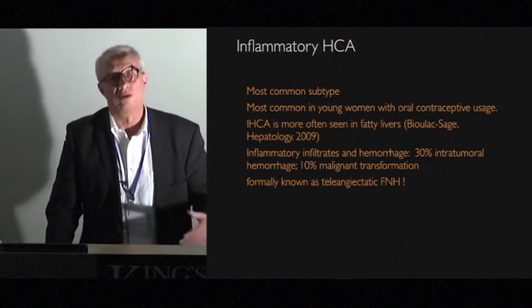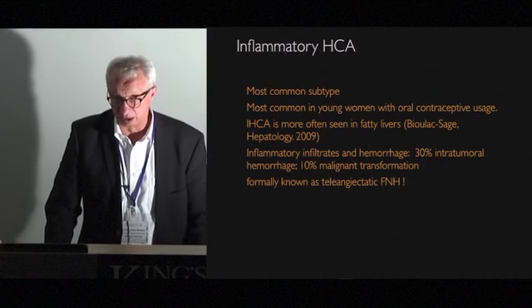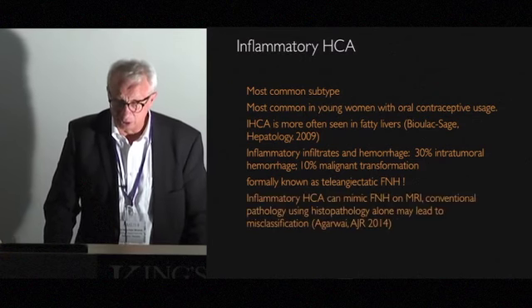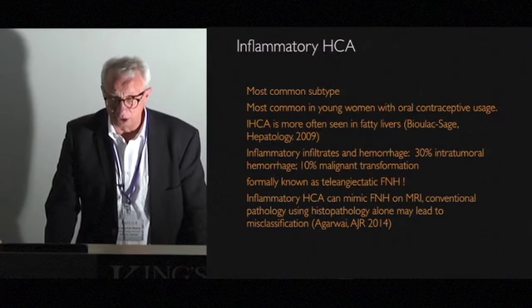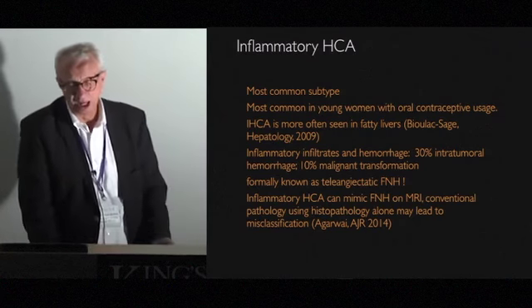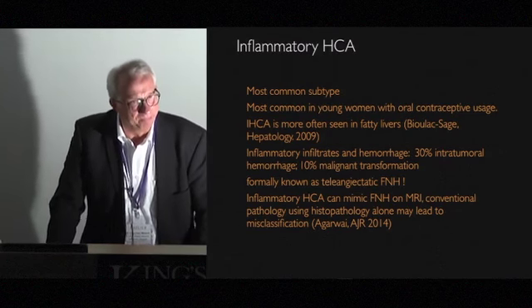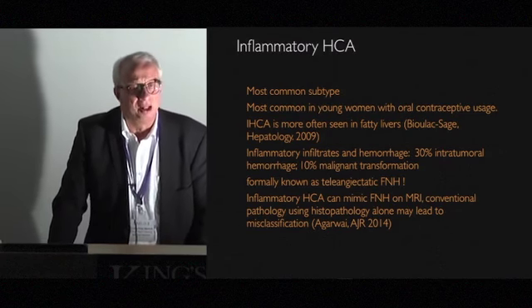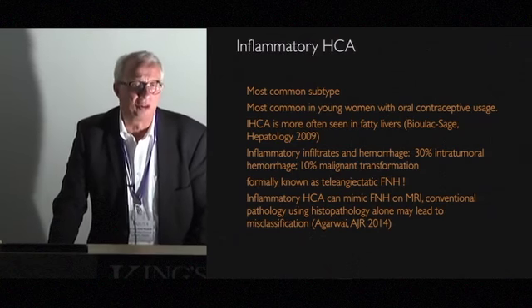So this term should no longer be used, as most of the authors state. Inflammatory HCA can mimic FNH on MRI. Conventional pathology using histopathology alone may lead to misclassification. And this again is an important point, because it very much depends on who is looking at the histology.